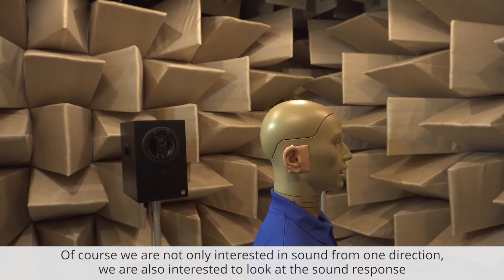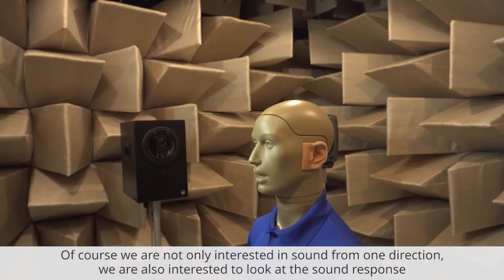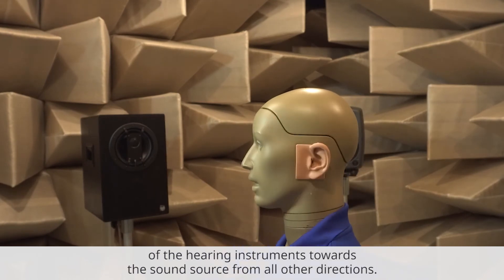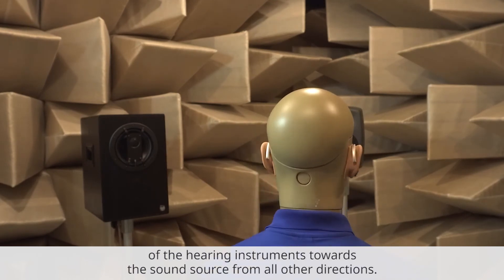Of course, we are not only interested in sound from one direction. We are also interested to look at the sound response of the hearing instruments towards sound sources from all other directions.